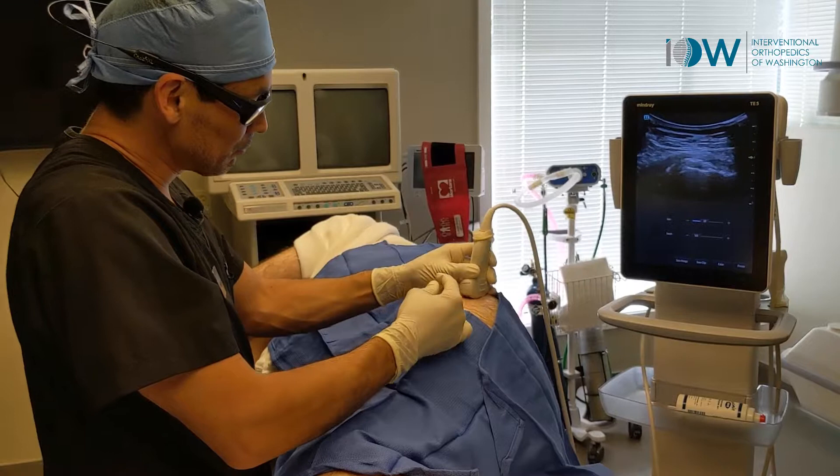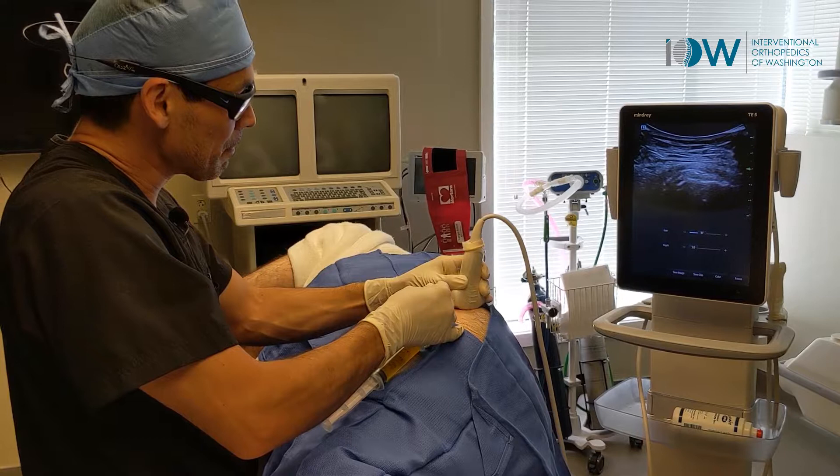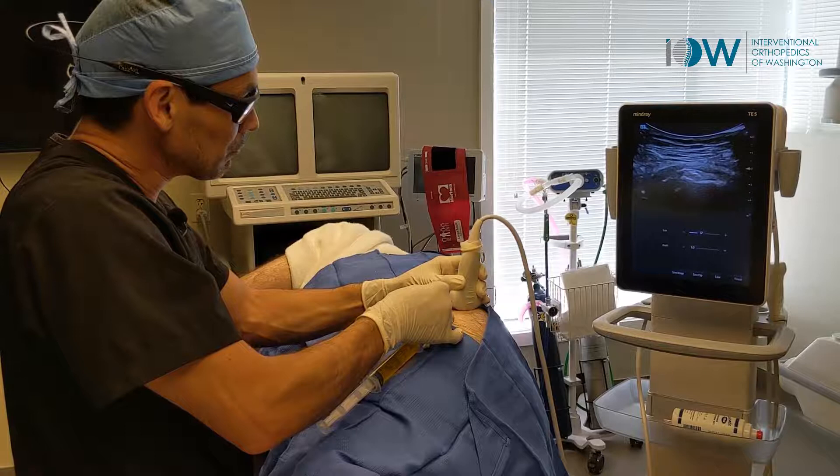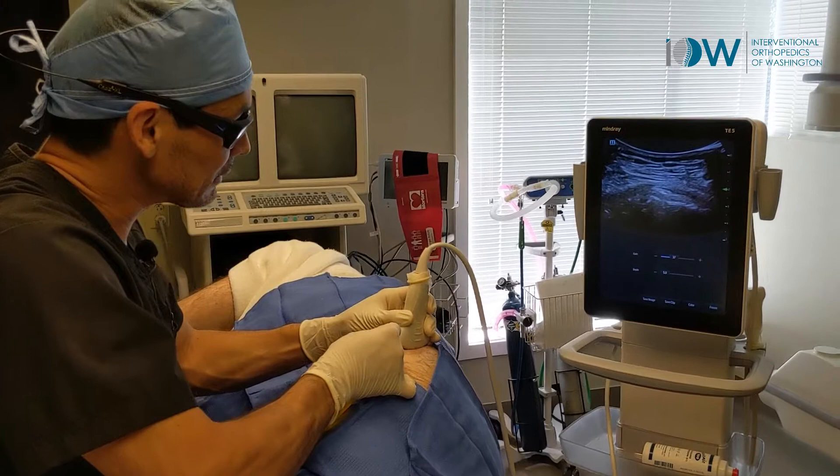I've already done some numbing so that this patient is comfortable through this procedure. We're just scanning the joint, getting right around where that is the most pathologic.